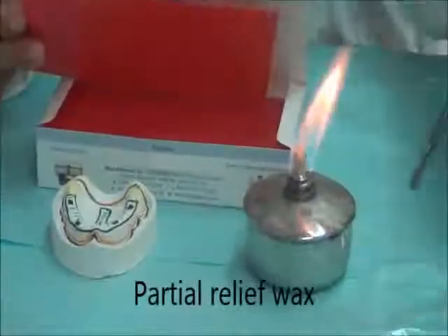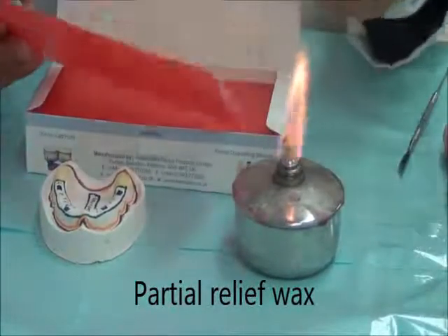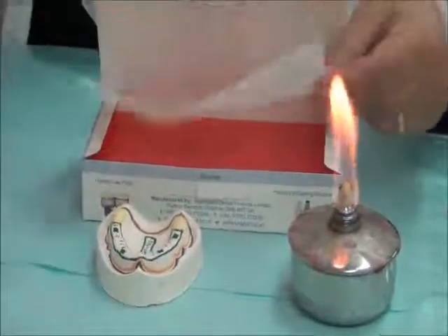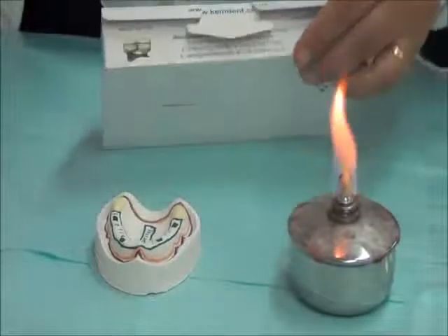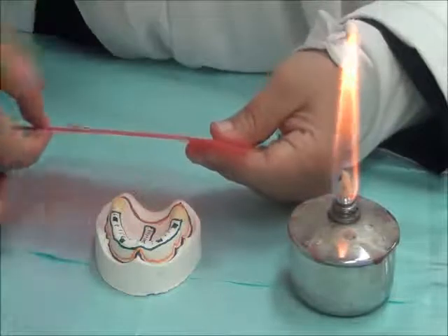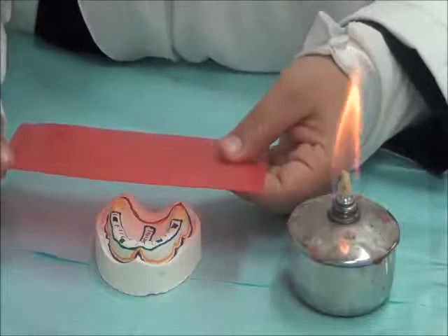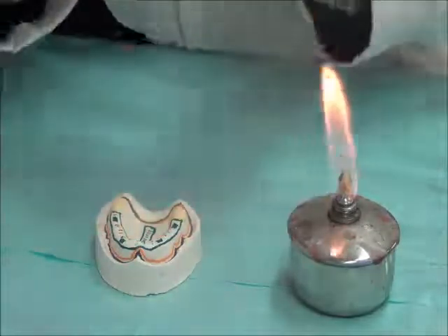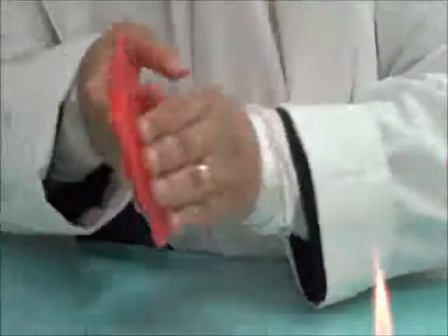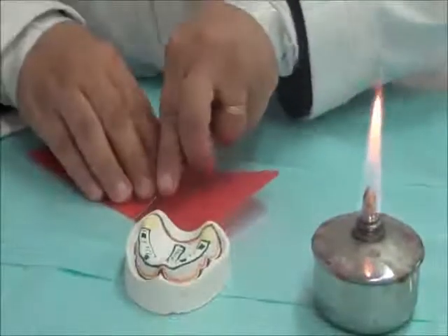Now, to make the partial relief wax, we're going to use a wax that has a known thickness. Base plate wax comes in boxes, and it's usually pink or red. This wax has a uniform thickness of 1.3 to 1.5 millimeters. So we're going to use this as our spacer. We're going to do one for the upper, so we're going to cut enough material for the upper only.